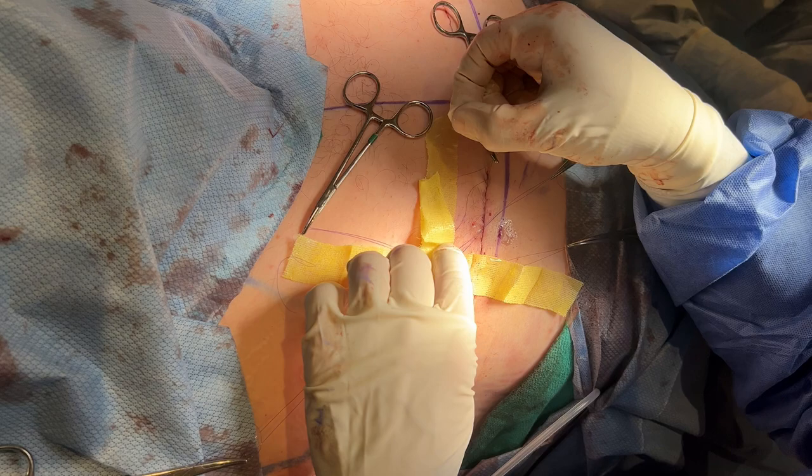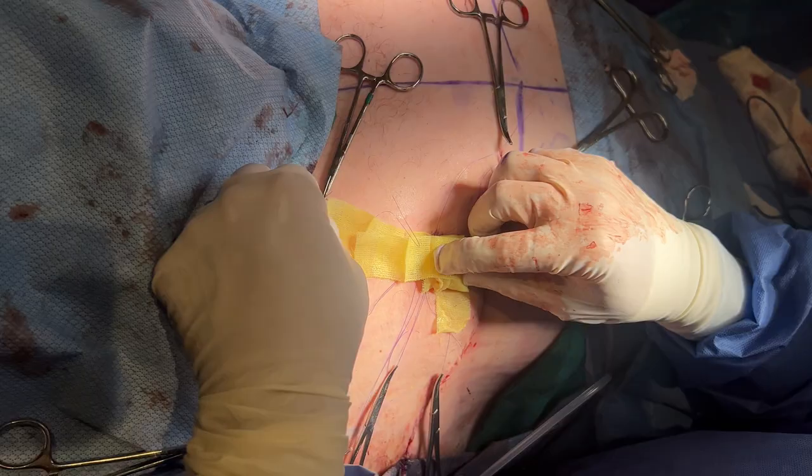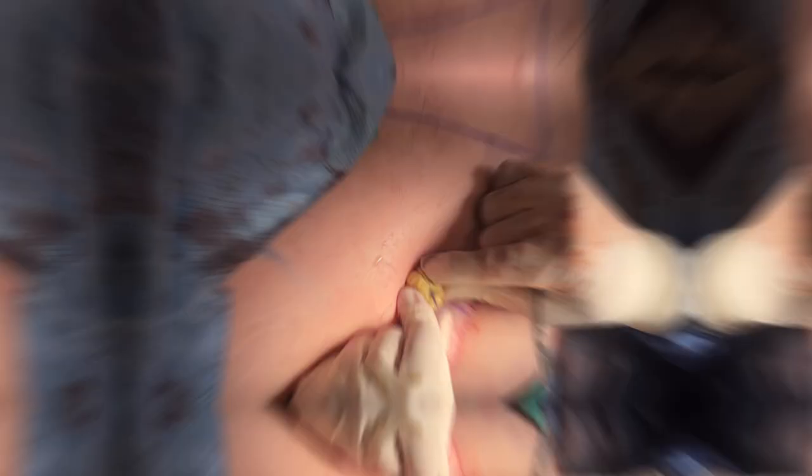Next, we wrap this all up and use the sutures to tie it down so it stays firm and the graft adheres to the skin. This is what we call a bolster.